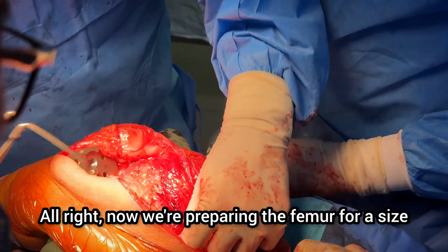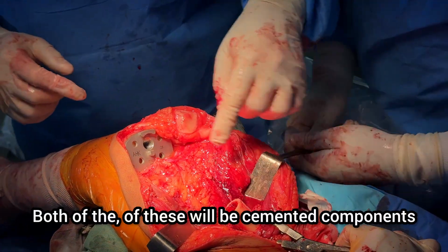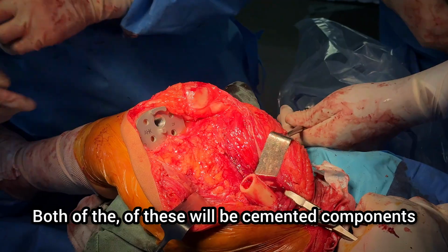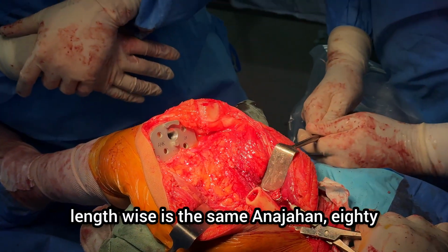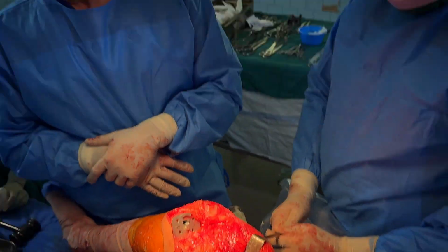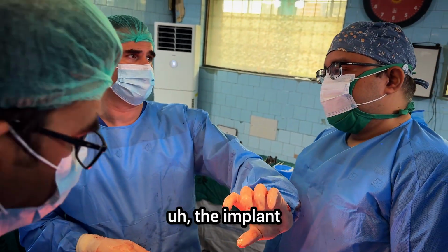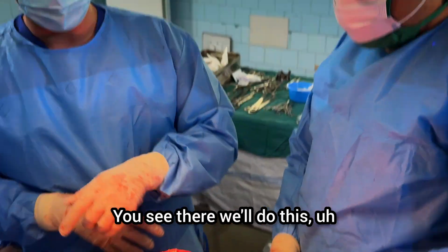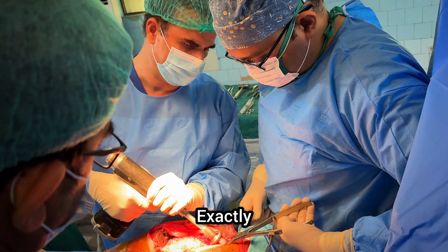Alright, now we're preparing the femur to take a size 9. Both of these will be cemented components, and lengthwise it is the same, around 80. So we're going to prime this up to take the implant. You see there, we'll do a bit of a rasping sort of thing here. Exactly, it's like a filer.